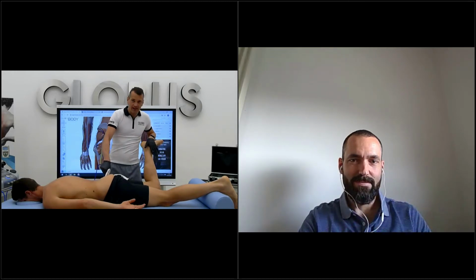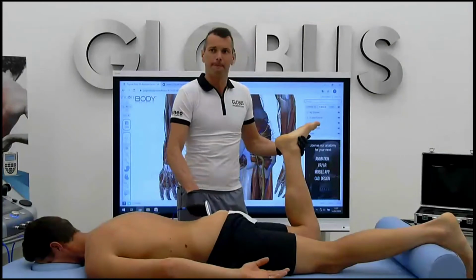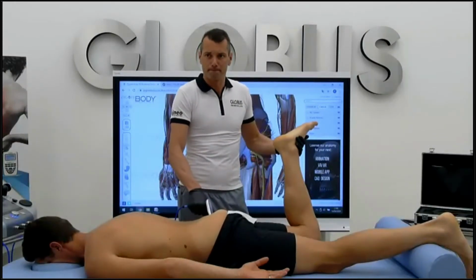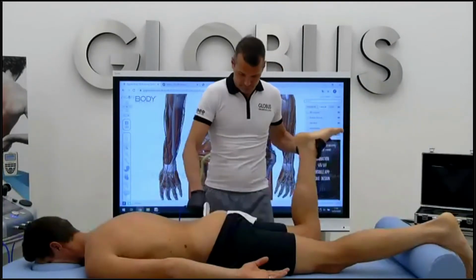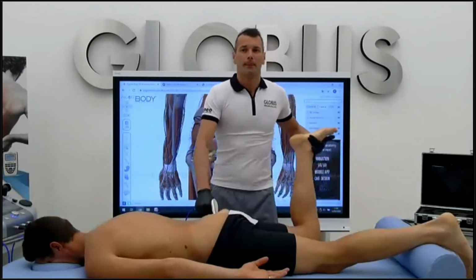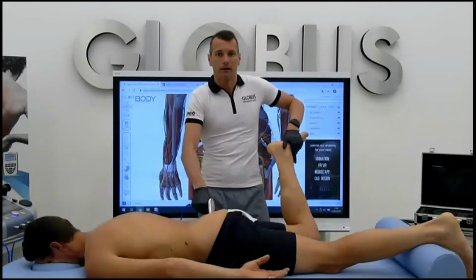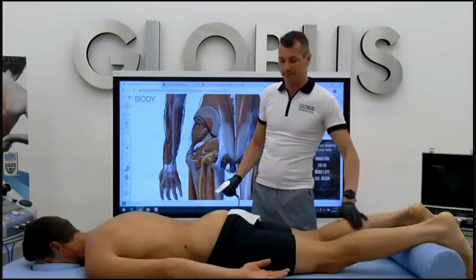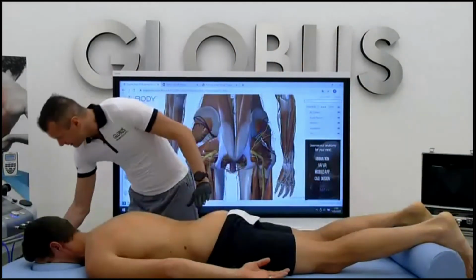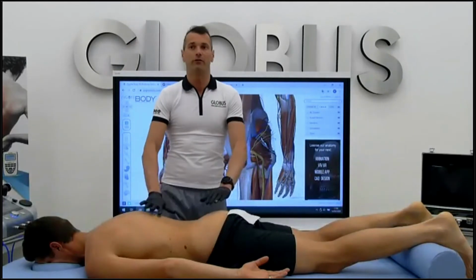There is a question, Enrico, about petechias that you told us before. One of the participants asked, with the fascia tool, is it normal that petechias appear? Women in particular do not like to have marks on their skin. Right. How to avoid petechias? Yeah, we need to do the proper treatment with a good level of warming of the tissue.